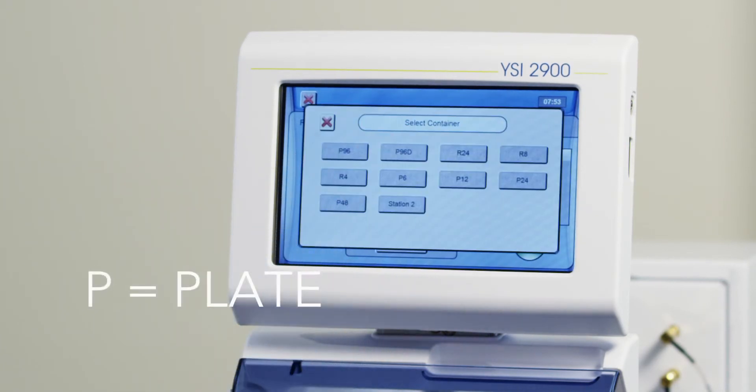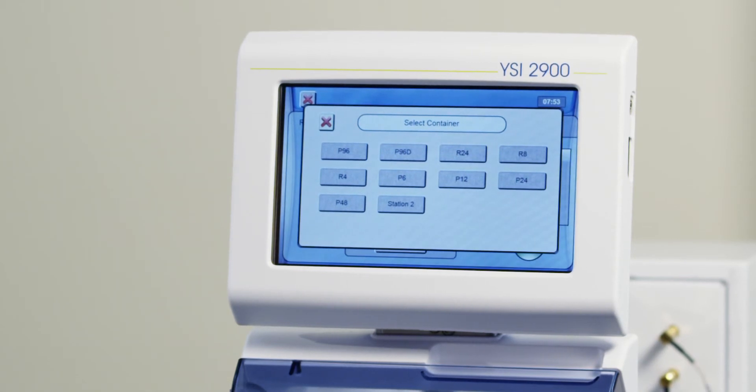P stands for Plate, and the number next to the P represents the number of wells in that plate. P96 is a 96-well plate. P96D is a deep-well 96-well plate. R stands for Rack, and the number next to the R is the number of tubes that rack can hold. Station 2 indicates that the sample will be presented manually to Station 2.